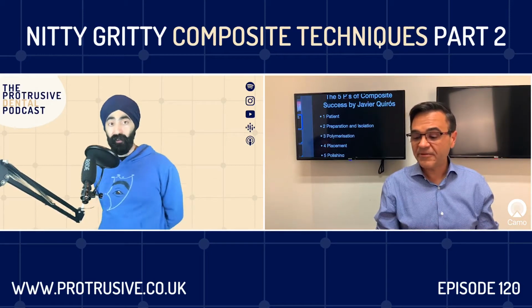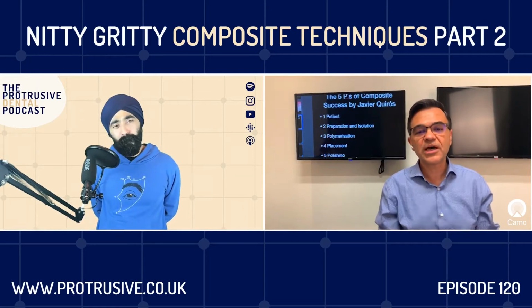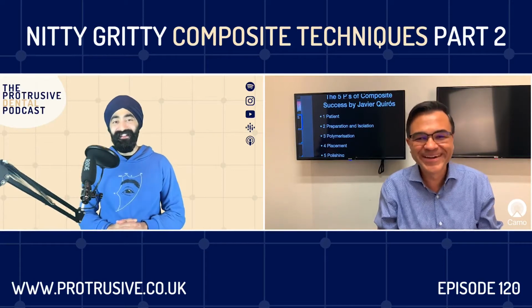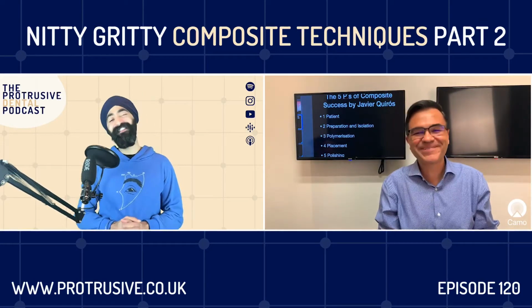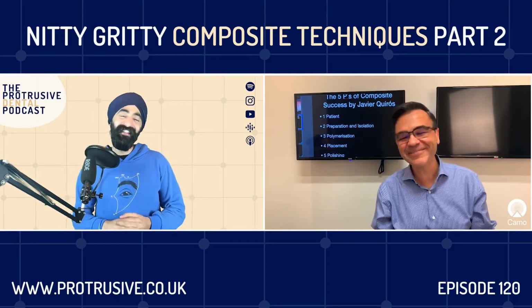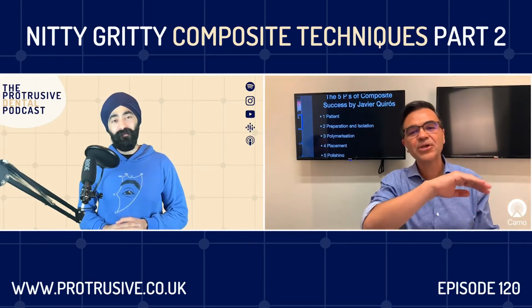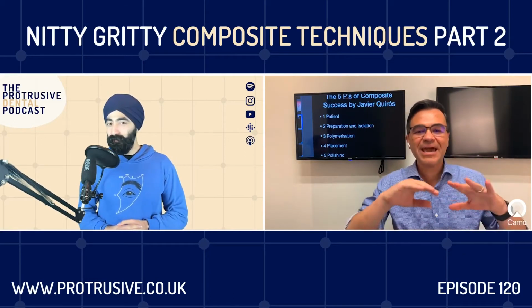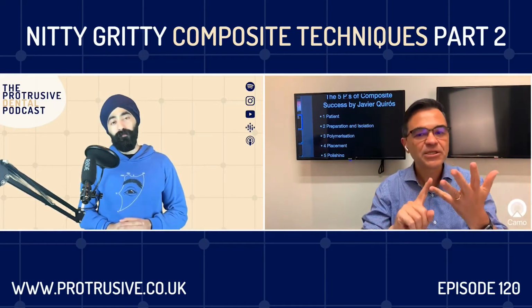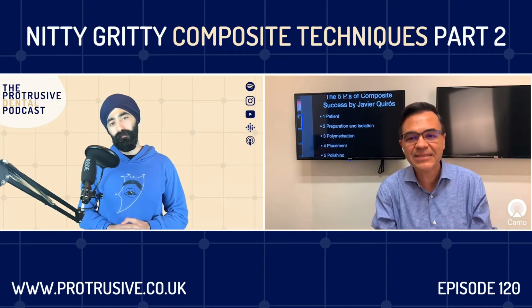Sorry for interjecting. Yeah, the polymerization, Jazz, those $75 eBay curing lights will not do for you. Don't you agree? Who would have thought? We're all tempted to buy those $75 curing lights, but you need, first of all, those expensive curing lights, they have all the wavelengths that you need for every single material, either if it's dual cure or light cure or any material that needs a light.